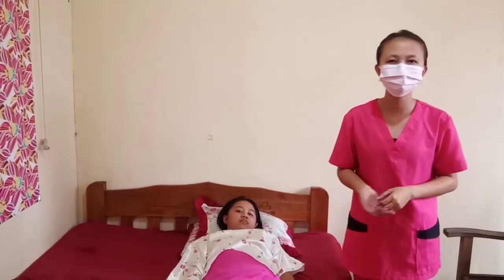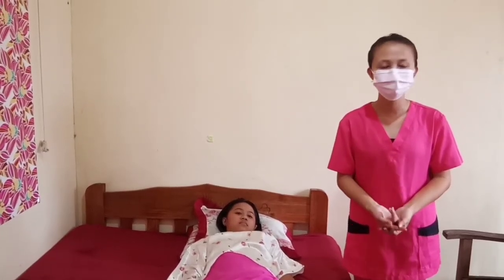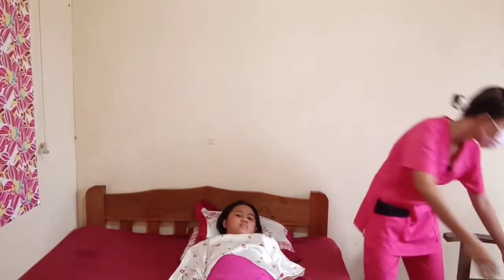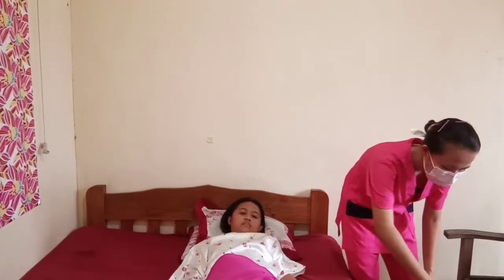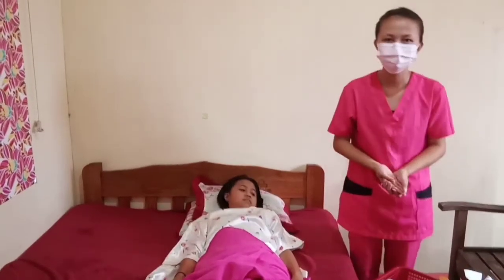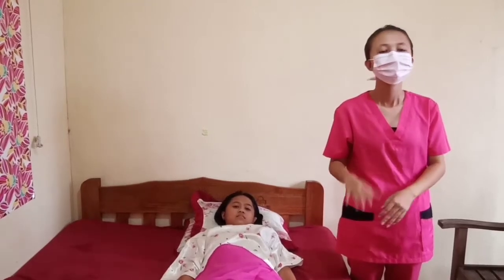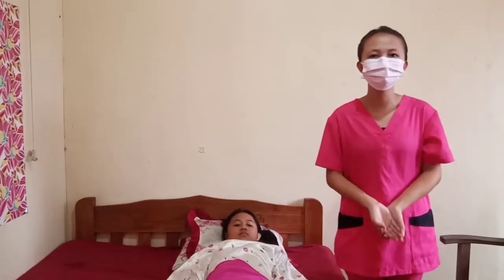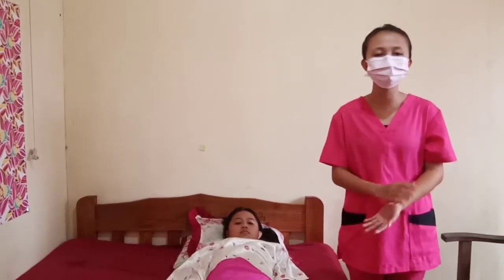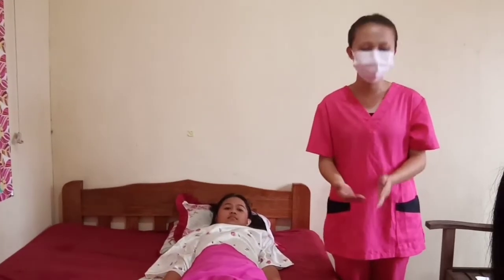And now it's time to open sterile dressing tray or individual wrapped sterile supplies placed on bedside table. So I have here the separated wrapped sterile supplies. And now we're going to proceed to dry dressing. So in dry dressing, the first procedure is open bottle of solution and then pour it into sterile basin.